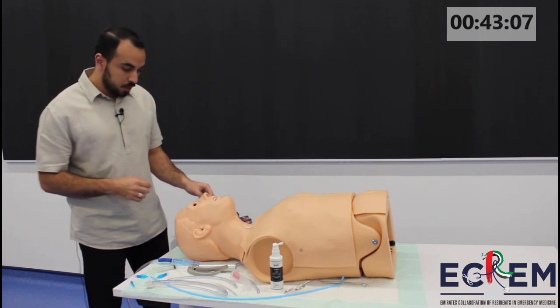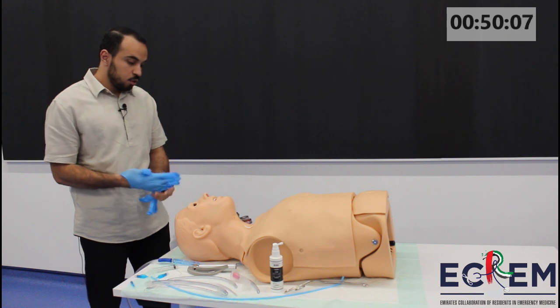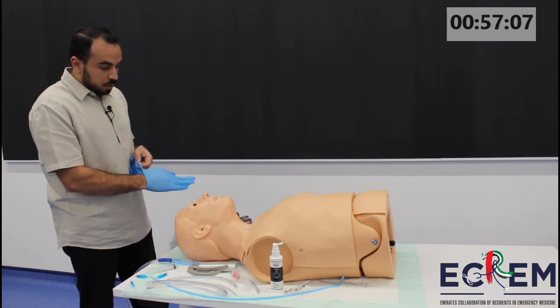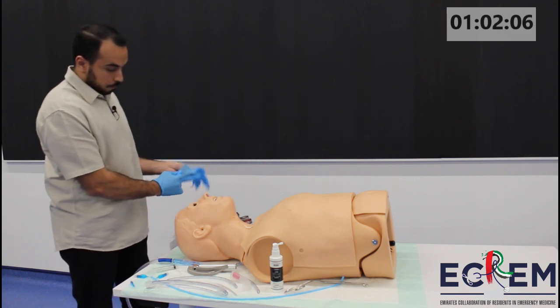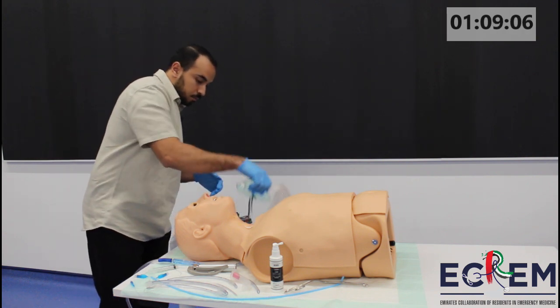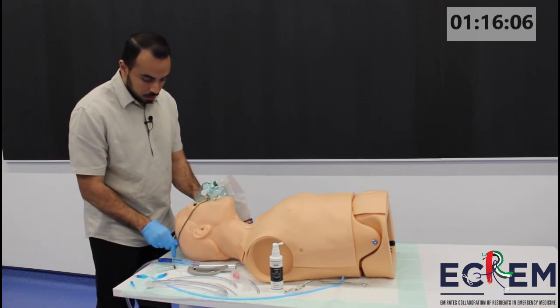Well, first of all, I'll start by wearing my PPEs and reassessing the patient. As it appears, the patient is in low GCS. So while I'm preparing my definitive airway, I'll put the patient on a 15-liter non-rebreather mask. This is my non-rebreather mask — just attach it to 15 liters and keep the patient on it.